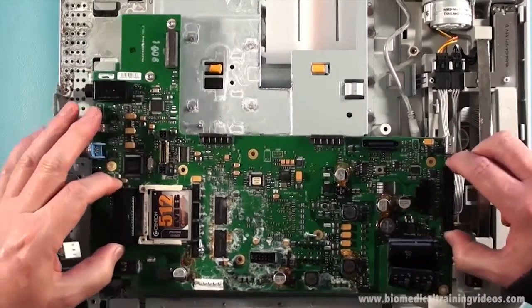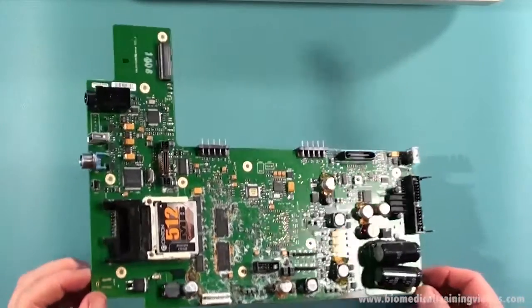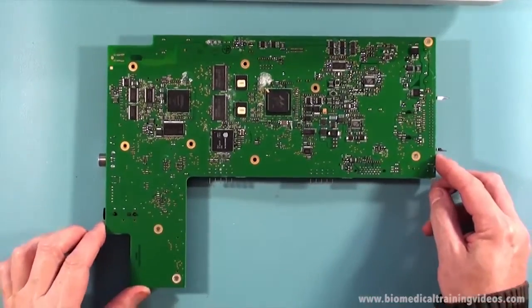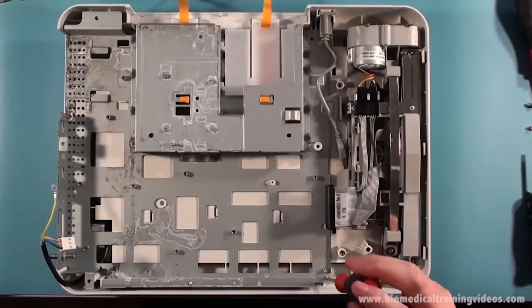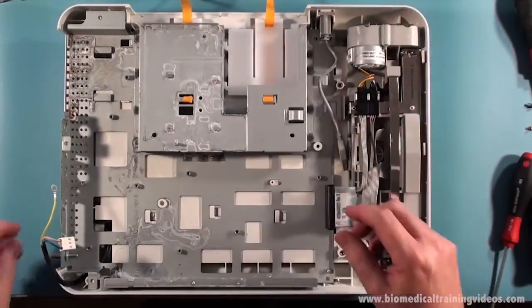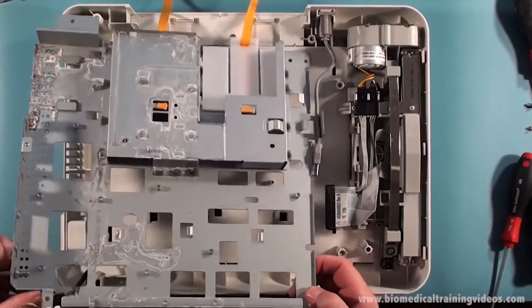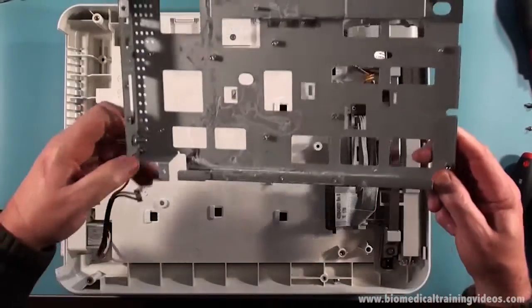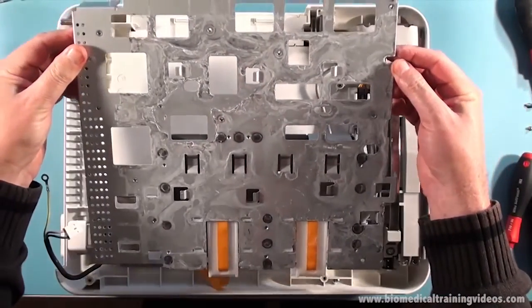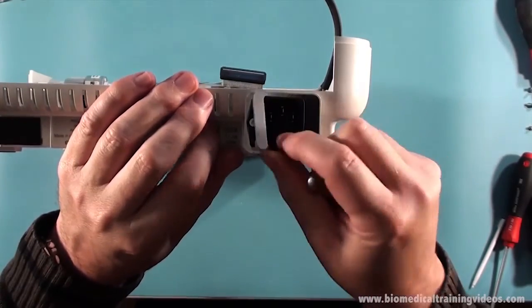Just lift it up and gently out, and there's the main board. Now we're just removing this metal internal chassis - one screw and the whole thing just slides and comes out. Very well put together. Again you wouldn't normally see all that corrosion and damage there. Showing the input connector there and how you would replace that.